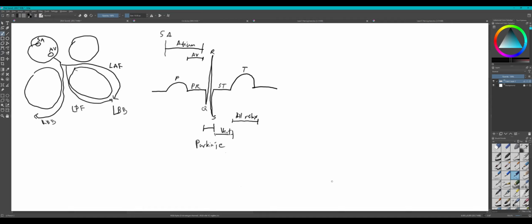Now, do you see the pink grid on the EKG? Let me know if you found one, Ian. Yeah, I got one. Okay. Now, you know how there's heavier, thicker lines, right? And little boxes. Good. We're going to talk about boxes. You ready?